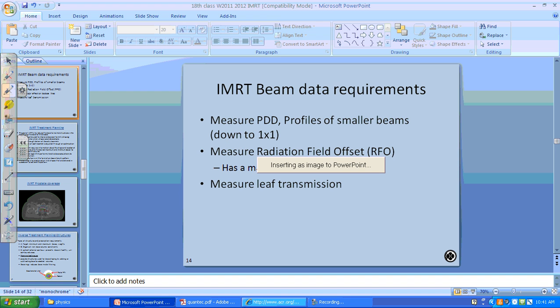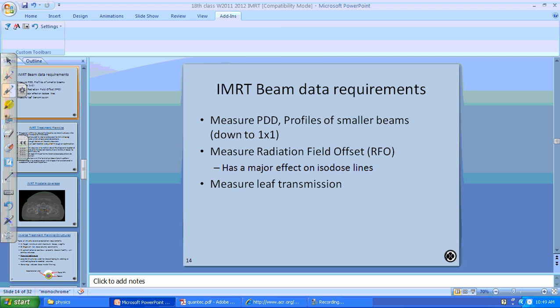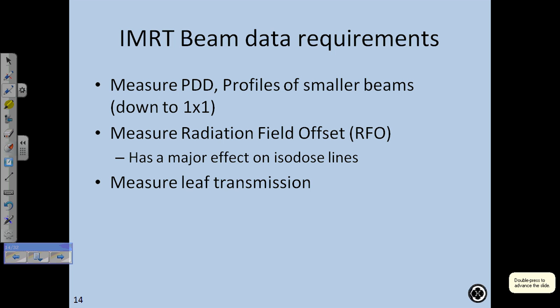All right, so let's get into some physics here. And this is just one quick slide on beam data I'm going to talk about because, in fact, choosing to do IMRT and asking yourself, well, what kind of new beam data do I need to do IMRT is really not that big a leap. There isn't that much more. And here's what you need to do.